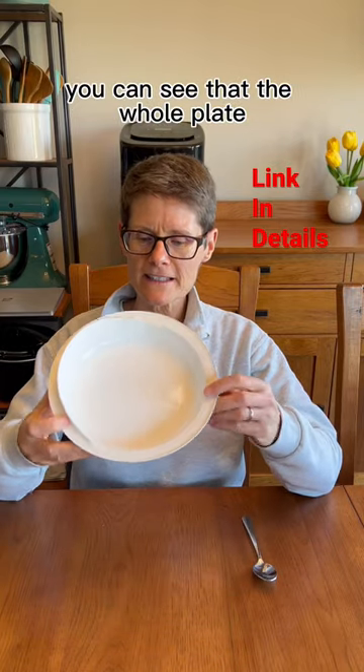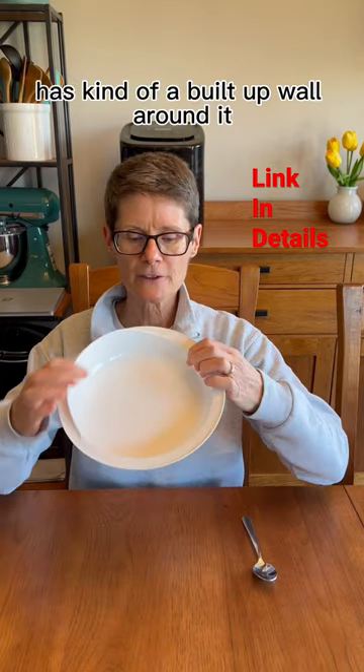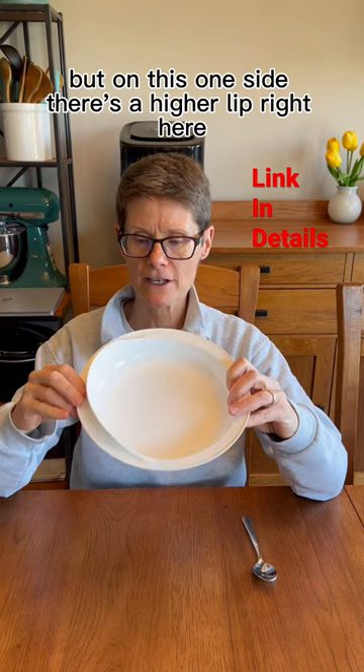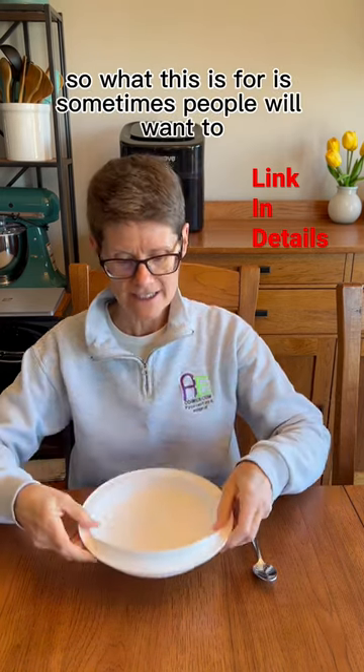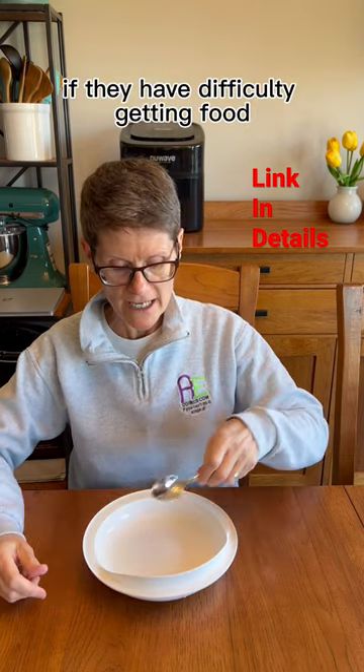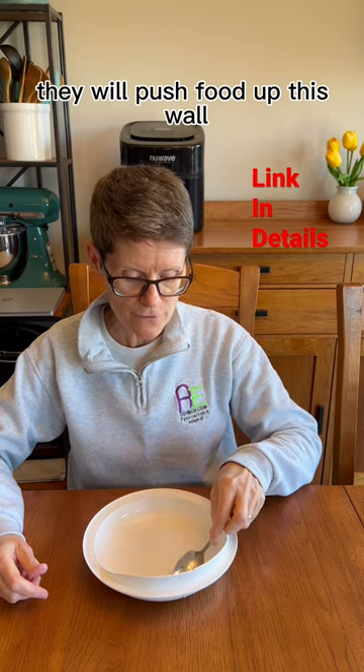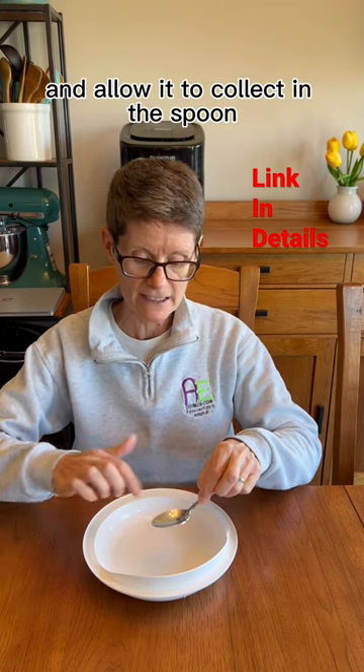This is a scoop plate. You can see that the whole plate has kind of a built-up wall around it, but on this one side there's a higher lip right here. So what this is for is sometimes people will want to, if they have difficulty getting food onto the spoon or the fork, they will push food up this wall and allow it to collect in the spoon.